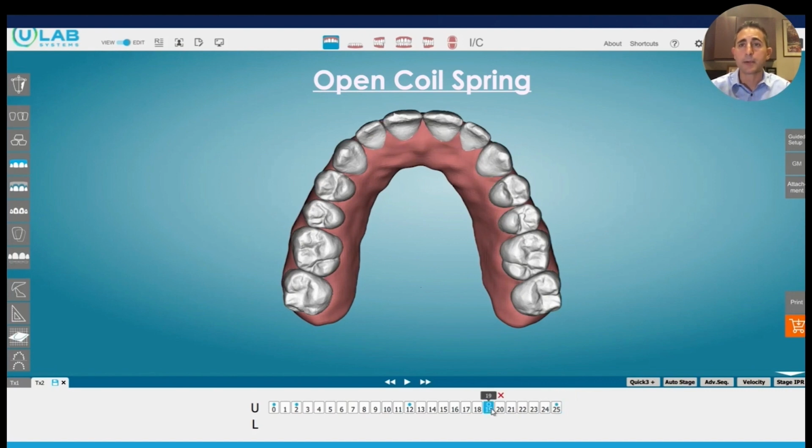And you know, traditionally I would say, oh, well, these teeth didn't track. I'm going to rescan and start over. But the aligners are still fitting on the teeth and the patient is still compliant. So I don't need to start over. So capture in your minds what this looks like.